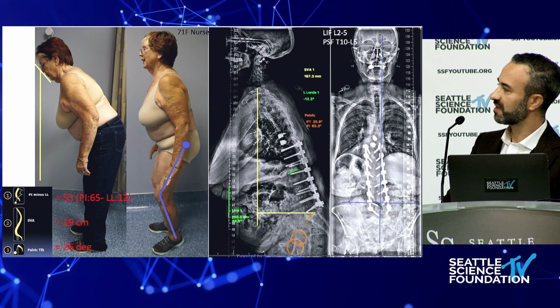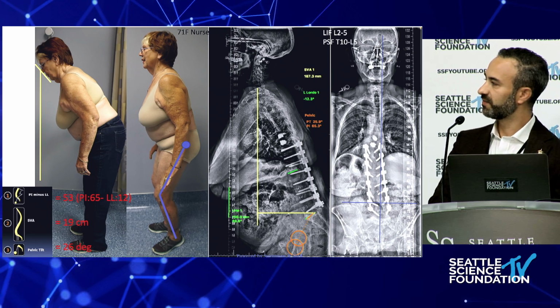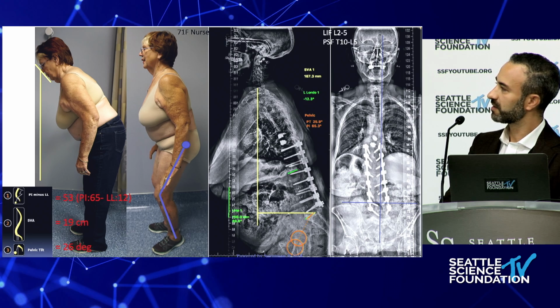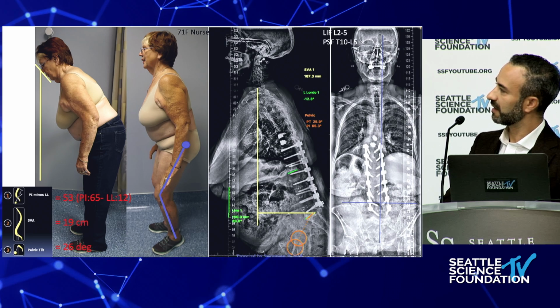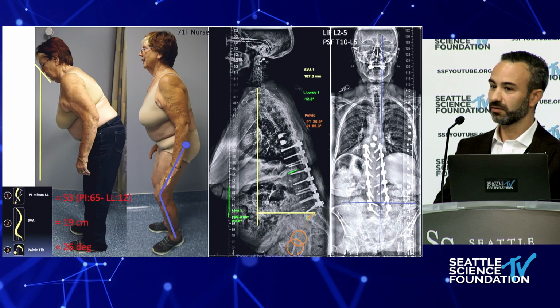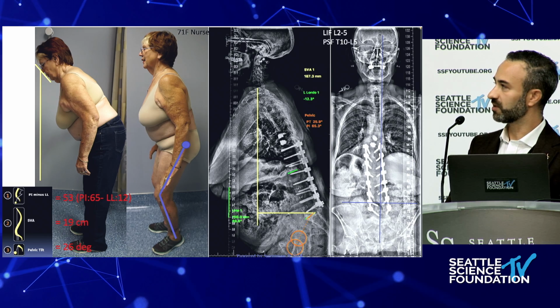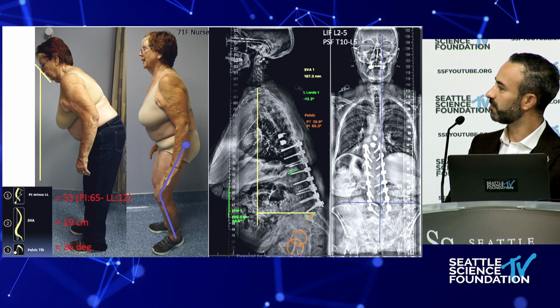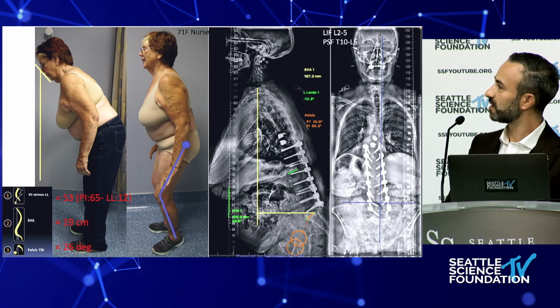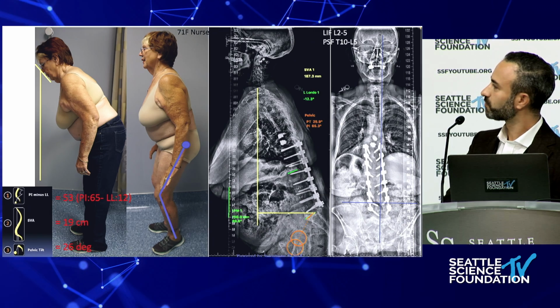This is another case example where the L5-S1 was not fused, thankfully. However, the patient was fused with lateral interbodies and a long construct, and even thought was given to PJK prevention with the cementing of UIV, UIV plus 1, UIV plus 2, but I think they forgot the rod benders that day, and so they got a pretty flat rod in there.